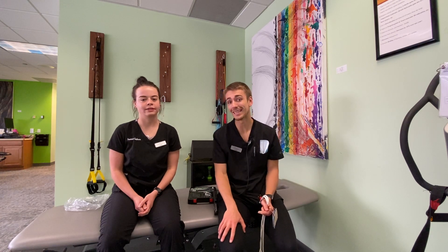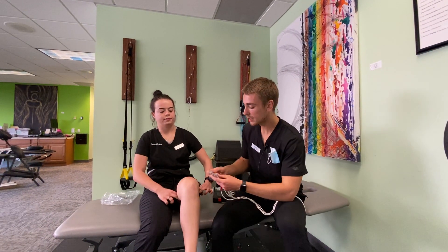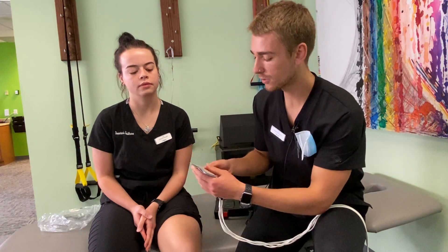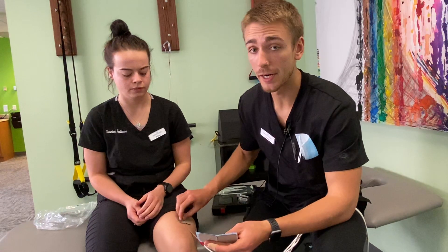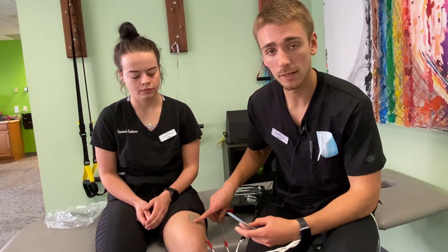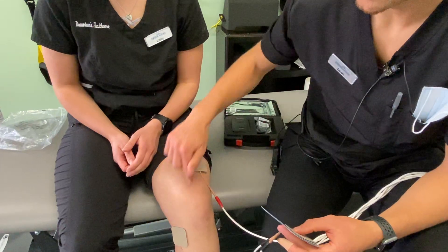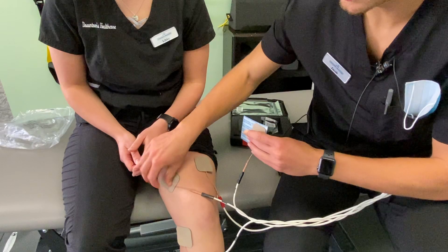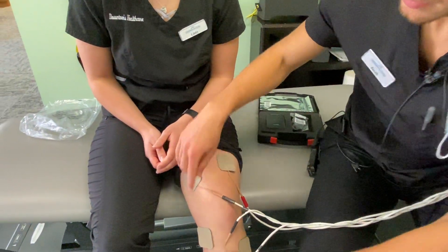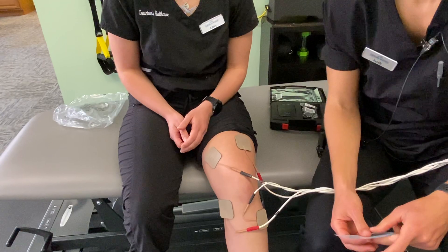On Libby today, I'm going to show the common example of knee pain and where we would recommend you to place the pads. When placing e-STIM pads, you'll notice you have two pads of two different colors — two black electrodes and two red electrodes. The important thing about placement is that you'll make a square with the four, but you want the same colors to be diagonal from each other. I have a red electrode in the upper right portion of her leg, and the second red electrode in the lower left, so they're kitty-corner from each other. Then I'll do the same with the two black — one in the upper left and the fourth in the lower right. This way the current will cross and center right across the kneecap and stimulate the surrounding musculature, providing the most pain relief for knee pain.